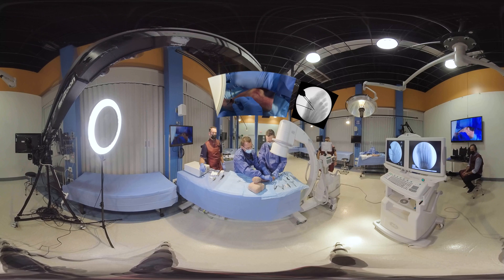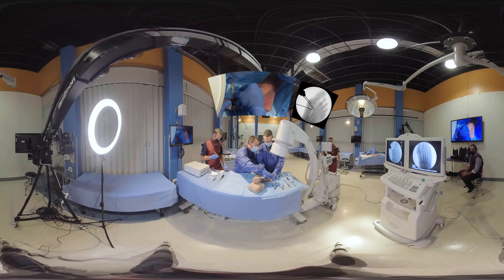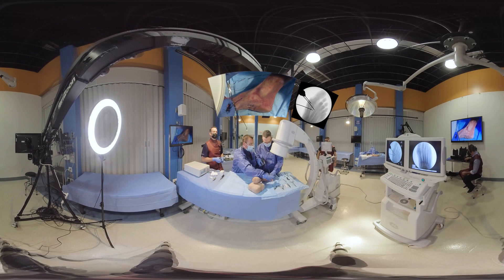So now we have an osteotomy guide. This is a saw osteotomy. You can also do it with multiple drill holes and an osteotome, which I've done in the past. But the saw cut allows for easier translation and rotation, as opposed to the multiple drill hole osteotome osteotomy — both of which heal very similarly. So it's surgeon choice.